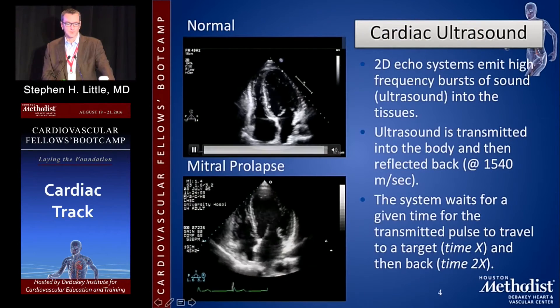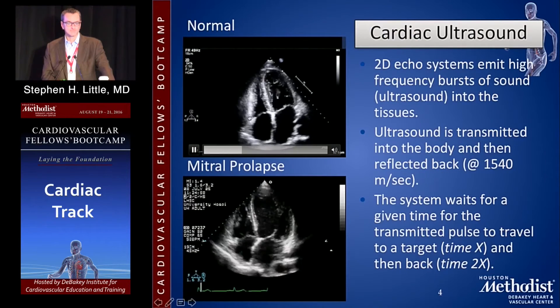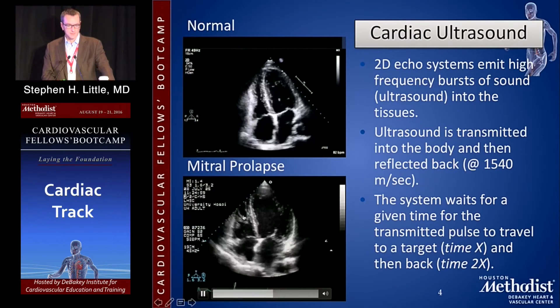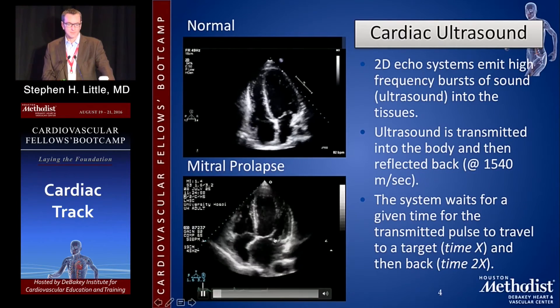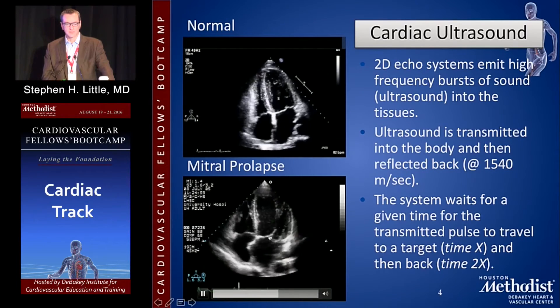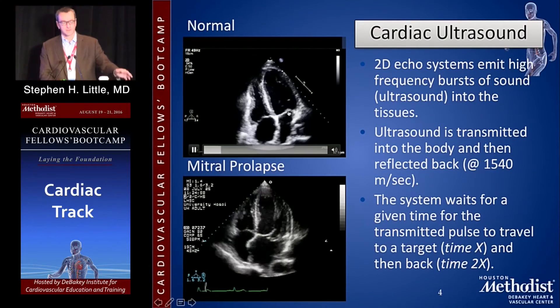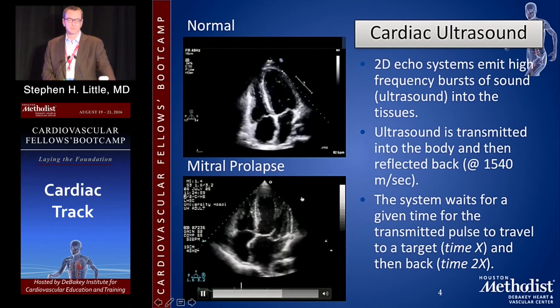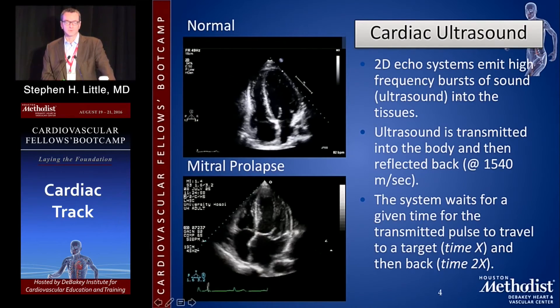This is a normal apical four-chamber view. The probe's right at the apex — you're seeing all four chambers. The left chambers are on the right side of the image. Another example shows prolapse of the posterior leaf of the mitral valve. The only reason the image can make that determination is it sent the ultrasound beam, waited for the return, and through complex Fourier transforms it determines that there's a prolapsing leaflet.